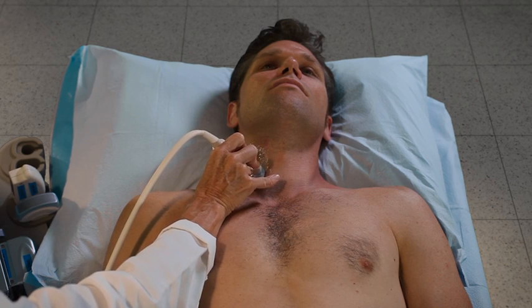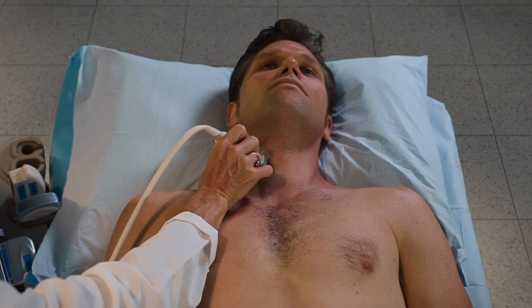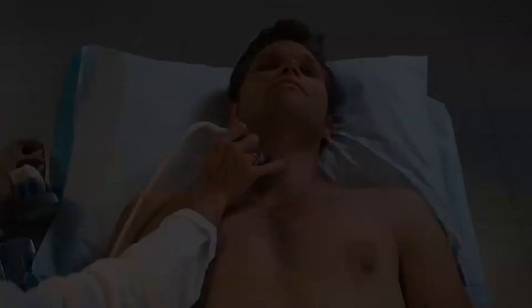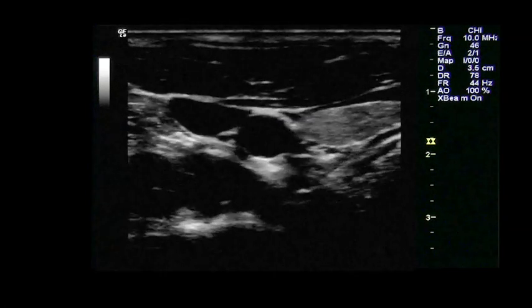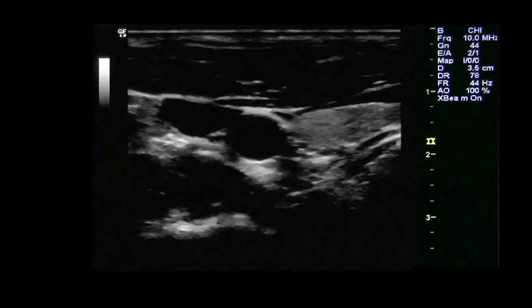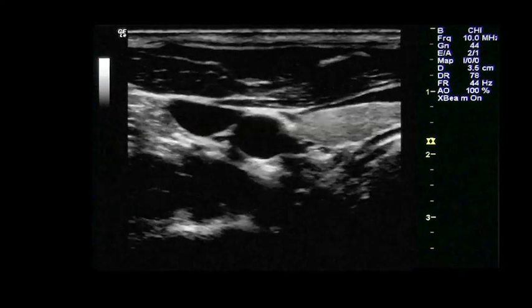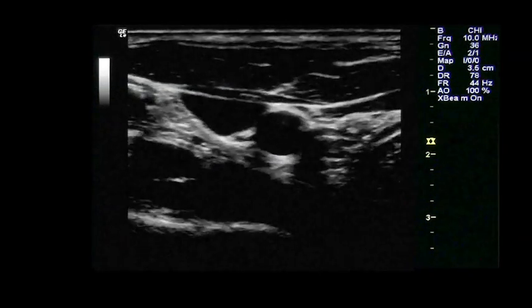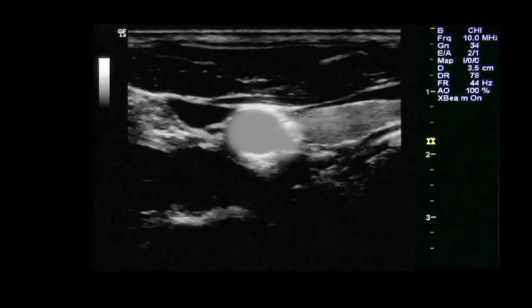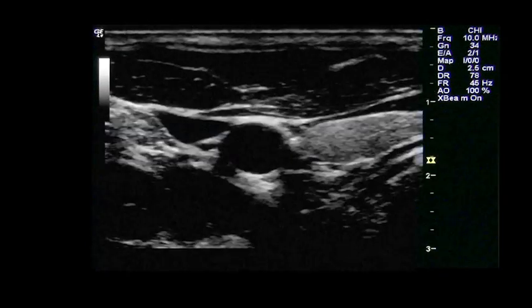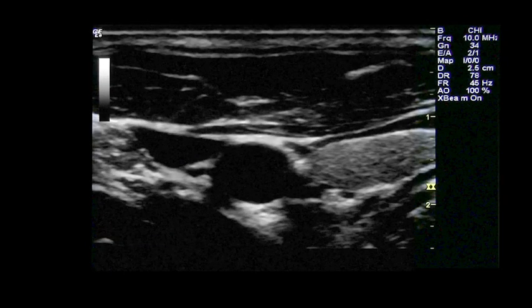Place the probe over the area of the right common carotid artery and internal jugular vein. For the transverse view, the probe marker should be facing the patient's right. The common carotid artery will appear circular and pulsatile. Adjust the position of the probe so that the common carotid artery appears in the center of the screen, and angle the probe so that the carotid artery appears round in cross section.